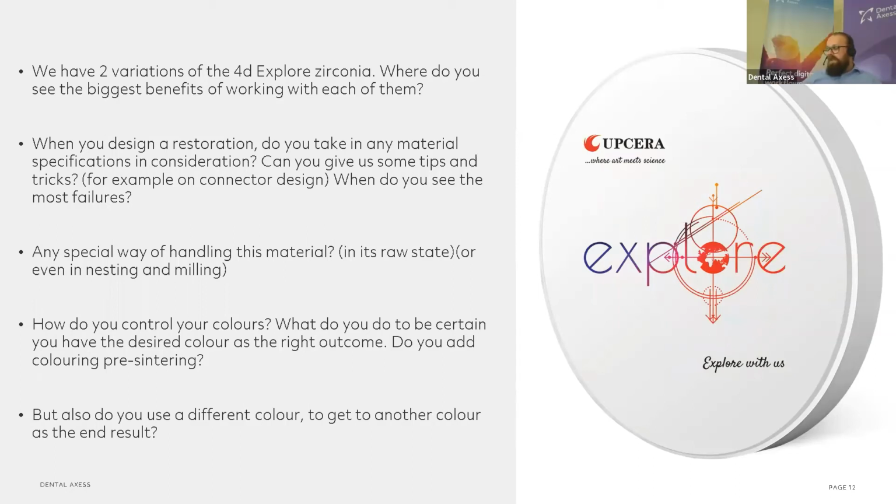Also, that definitely makes sense. So you said be very careful, because otherwise the color gets too intense easily. Yeah, I think that the reds could easily be overwhelming in general. So one has to be careful when you apply your liquids that you're not moving into that red zone.